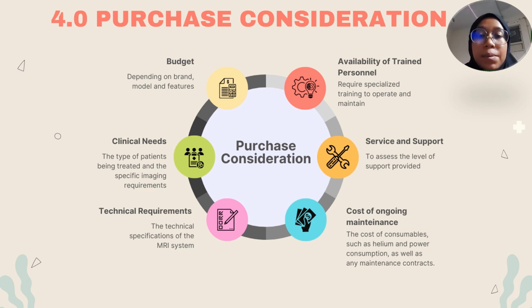and imaging capabilities. Fourth, availability of trained personnel. MRI machines require specialized training to operate and maintain. It's important to have appropriate personnel available to run and maintain the MRI system.